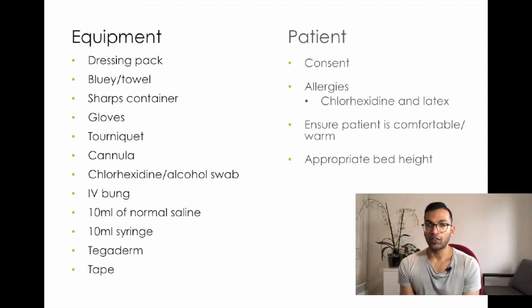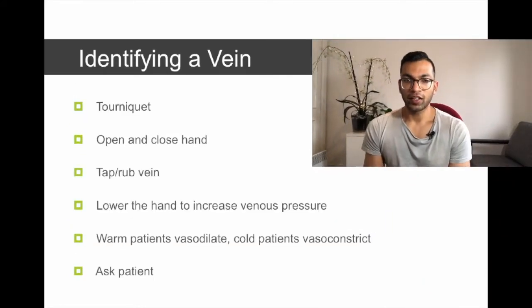Now, obviously take care of your own back, for example, by making sure that the bed height is appropriate. Identifying a vein is one of those things that you really want to spend a lot of time on. It's time really well spent.